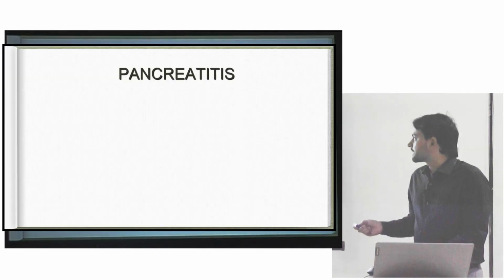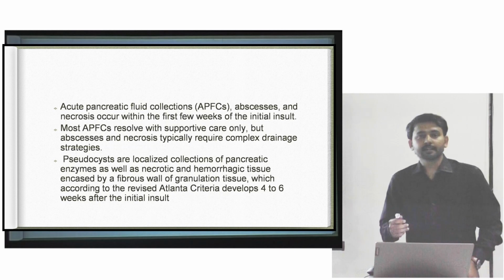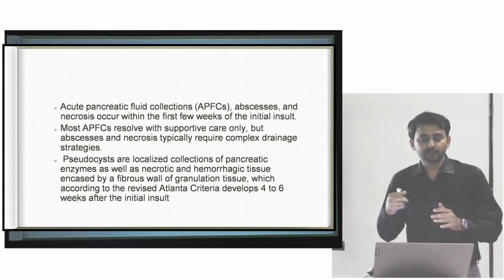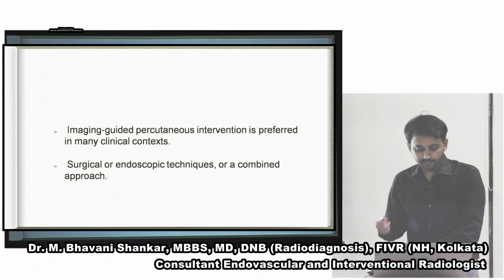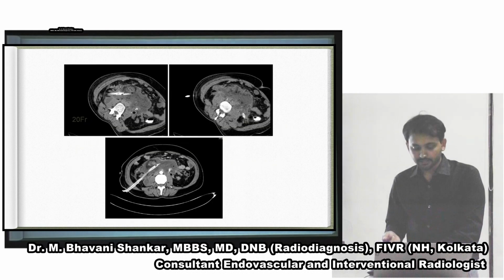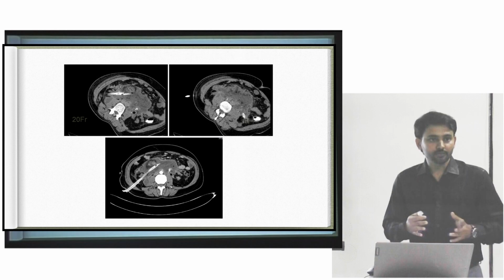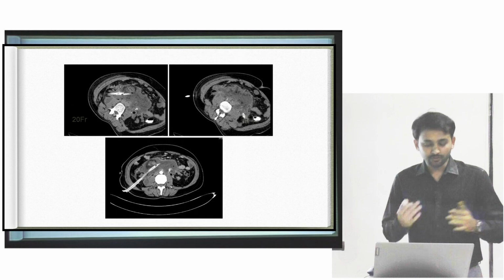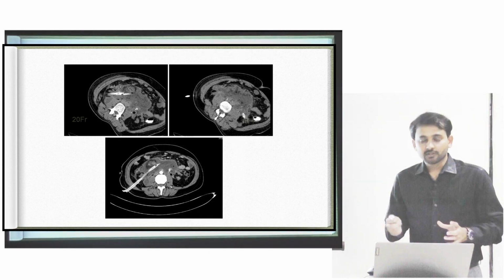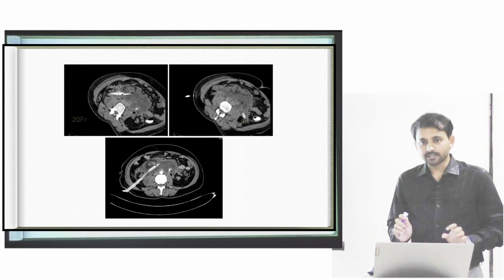And pancreatitis, another common condition. In pancreatitis where there are severe, large collections like walled-off necrosis or pseudocyst, we used to do percutaneous therapeutic aspirations and place large bore, wide bore catheters to avoid major surgical procedures like necrosectomy. We used to place 20, 24, sometimes 32 French Thal-Quick catheters also. So these will give beautiful results without any surgical intervention.